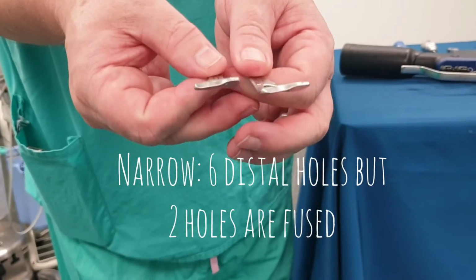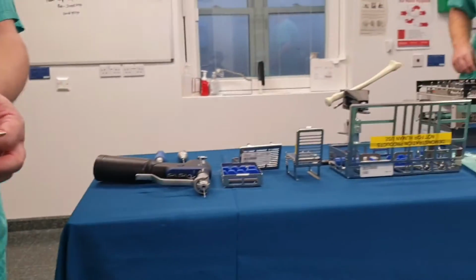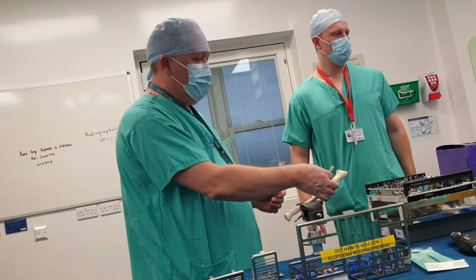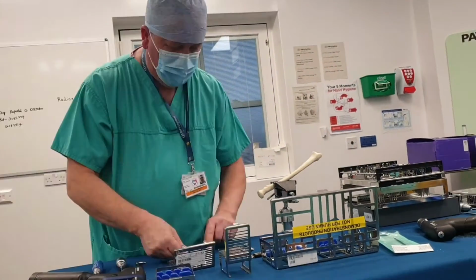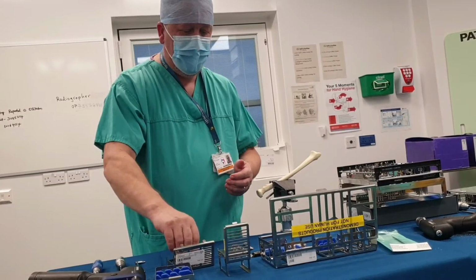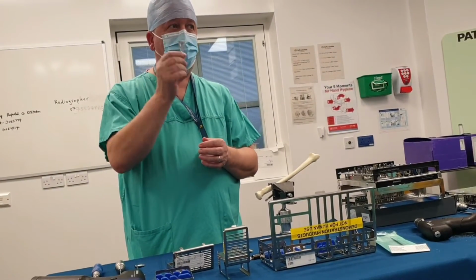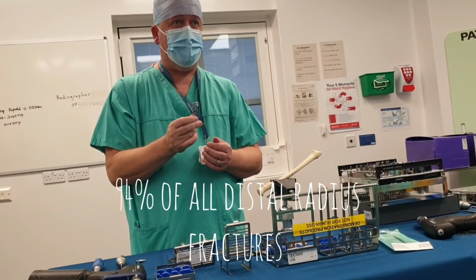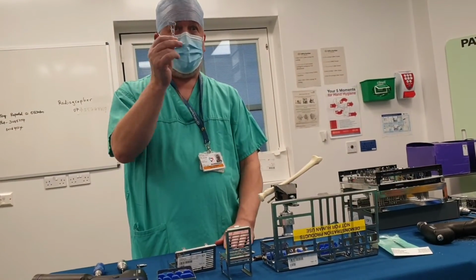That's the main difference between them. All right. So they will probably use the trial. They will tell you, right, I need to have a standard. When it comes to distal radius, the 2-column plate will fix 94% of all distal radius fractures. So this is always your go-to.